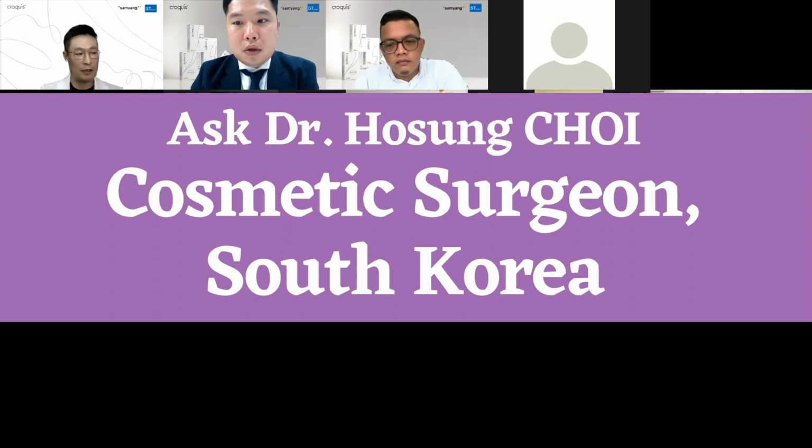But when about 10 to 20 threads are used, you can expect at least 5 months. For some patients, I experienced that the result lasted more than 6 months.